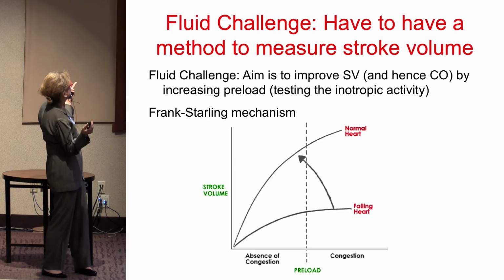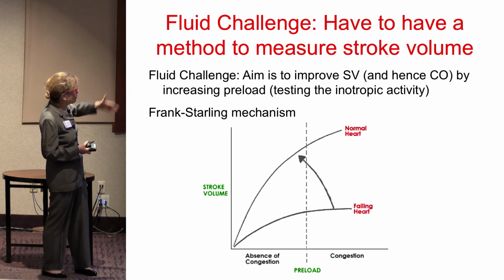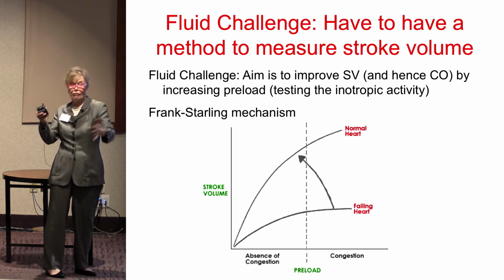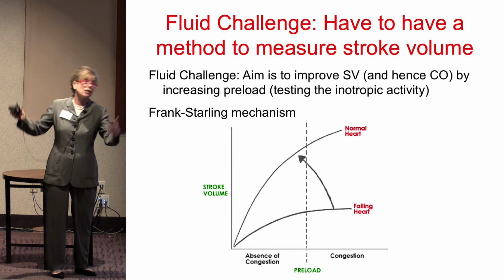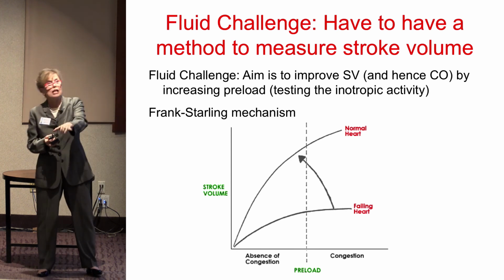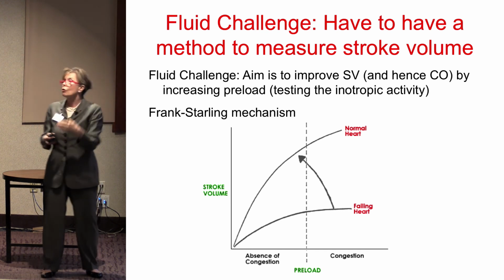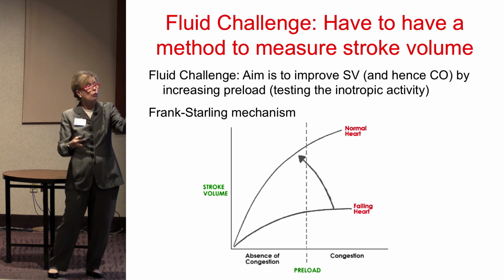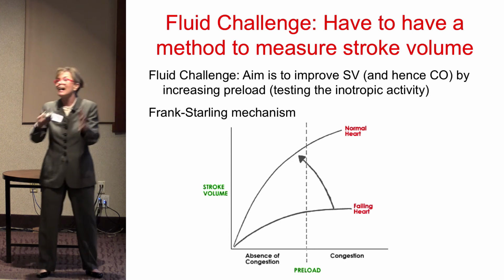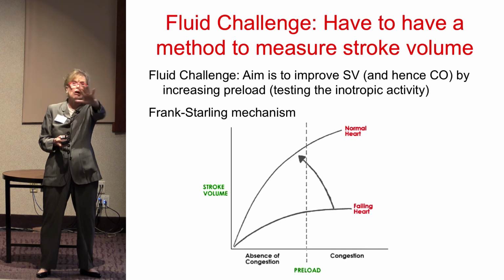Now, I love the good old Frank-Starling curve, just to remind us that our therapeutic interventions are about trying to maximize that stroke volume by our volume resuscitation and our inotropic resuscitation. It's really important to remind yourself that vasopressor resuscitation improves the blood pressure but limits the stroke volume at some point. So when we're evaluating patients at the bedside and titrating up on vasopressors, again, we want to look at the effect that has on our stroke volume because you want to meet that sweet spot, just like we talk about with ventilation.